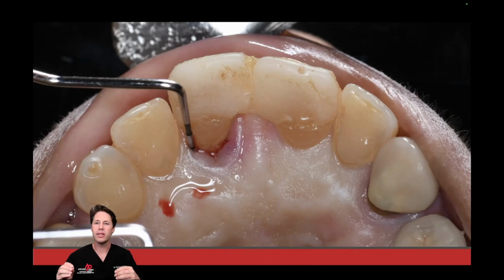What site is going to use more energy? Is it the inflamed area or is it the healthy area? It's the healthy area. You will use less energy on infected and inflamed tissues because the laser is going to work better because it's going to be selectively absorbed into those target tissues.